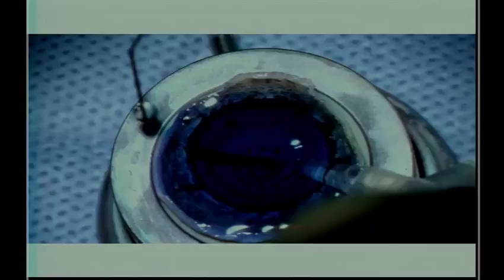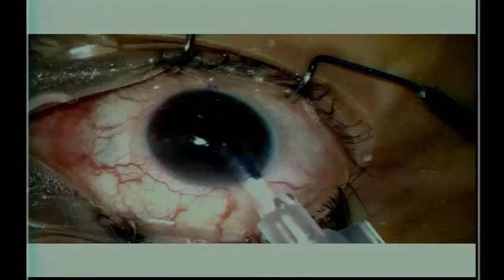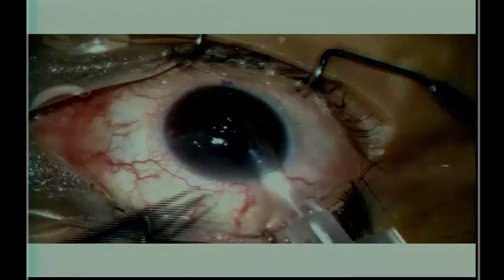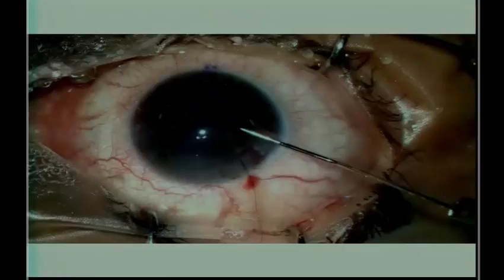So once you stain it, there are various ways of loading it into your cartridge. The eye should be soft, and there should not be any external pressure. As you would have seen in my surgery in the morning, the assistant had applied the speculum, so it was really tight. So if you have that kind of external pressure, your tissue can jump out of the eye.